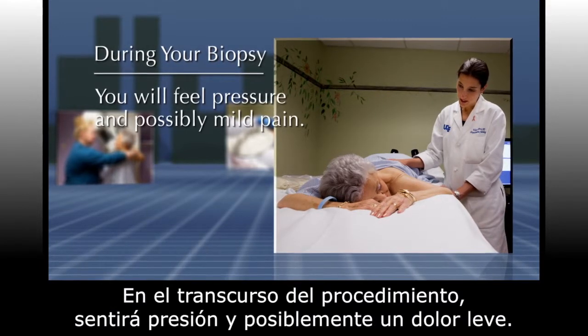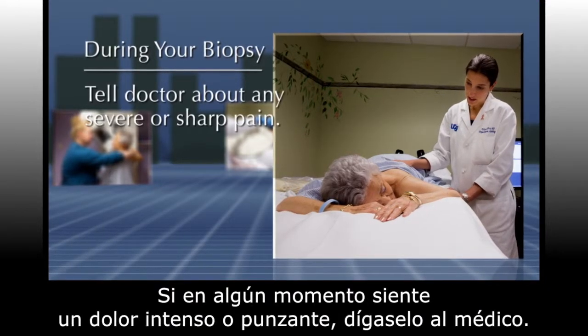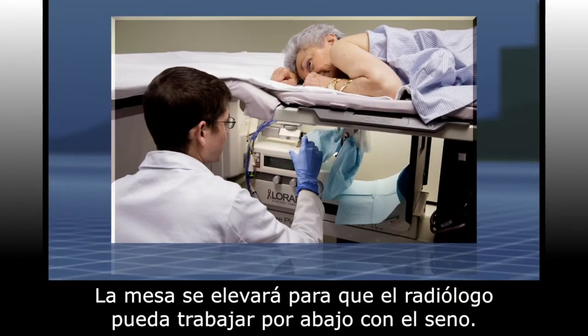You will feel pressure and possibly mild pain. If you feel severe or sharp pain at any time, let your doctor know. The table will be elevated so the radiologist can work on your breast beneath the table.